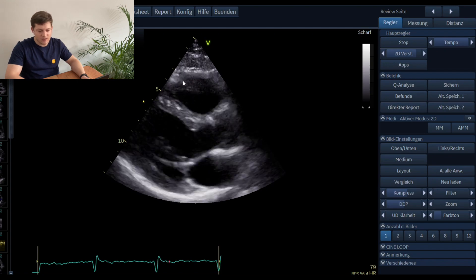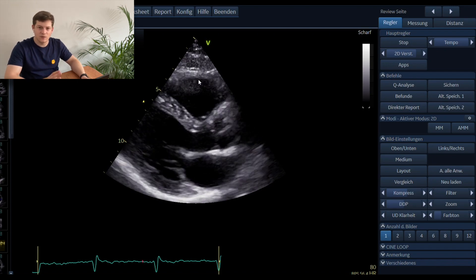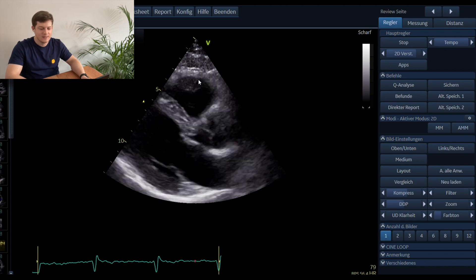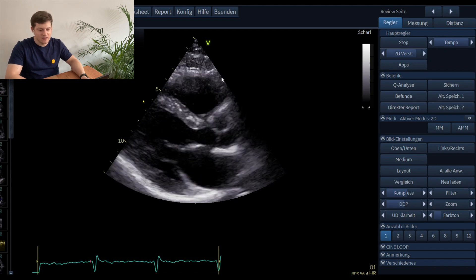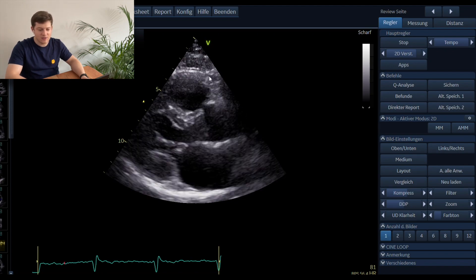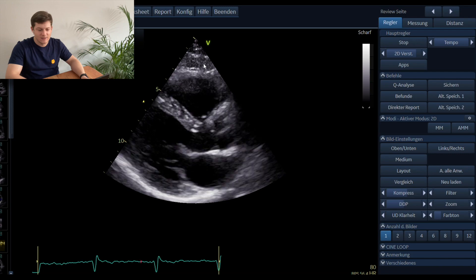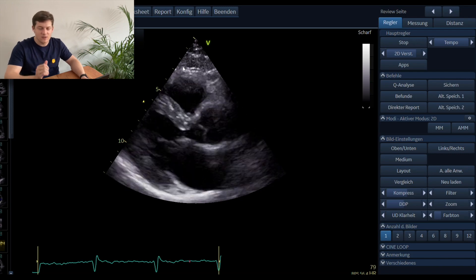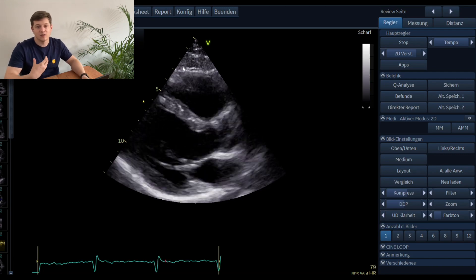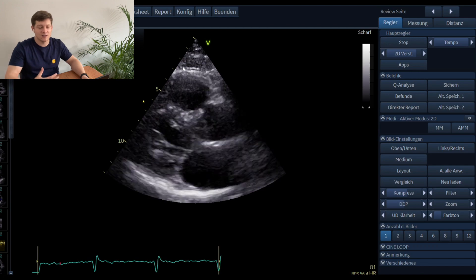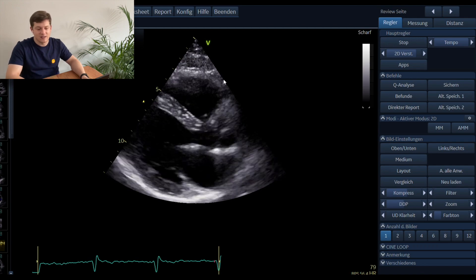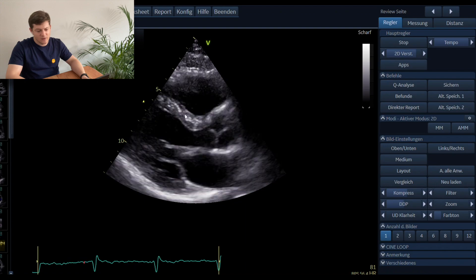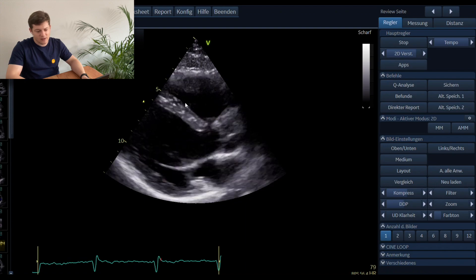When we start interpreting the parasternal long axis view, we start up here — that's the right ventricle. A very important piece of information you already get is right ventricular function: this is the right ventricular wall, and you can see how it's moving. You can already appreciate that right ventricular function, at least in this area, is normal.